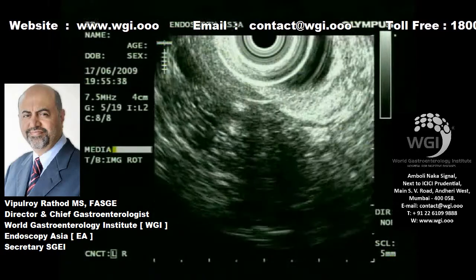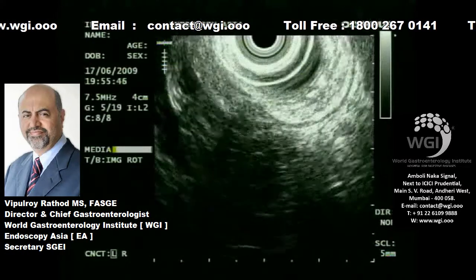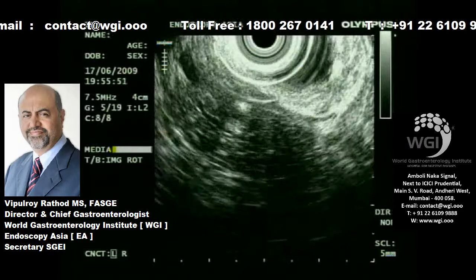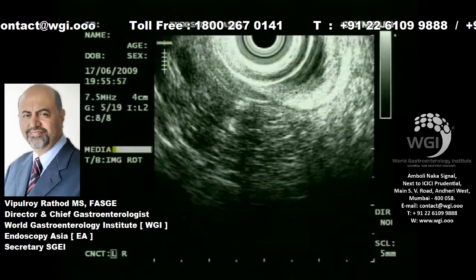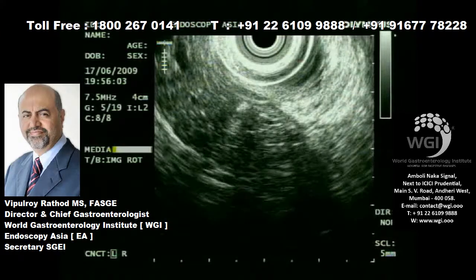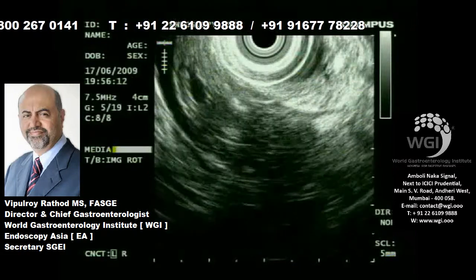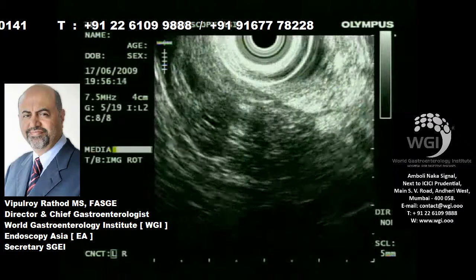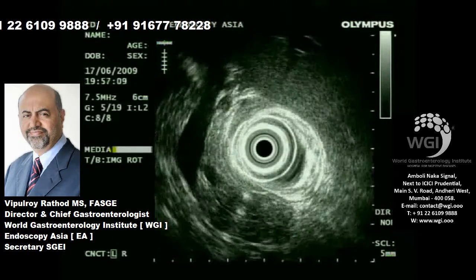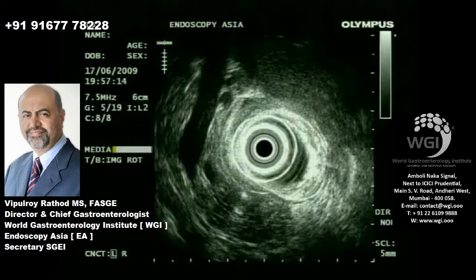We are dealing with a possibility of some pancreatic ductal anomaly, most likely pancreas divisum, and for inexperienced eyes it might be a little challenging, but it has been our experience since 1999. That was the first time we presented our data at DDW, our ability to pick up pancreas ductal anomaly on EUS.